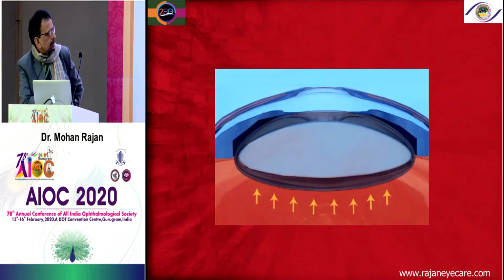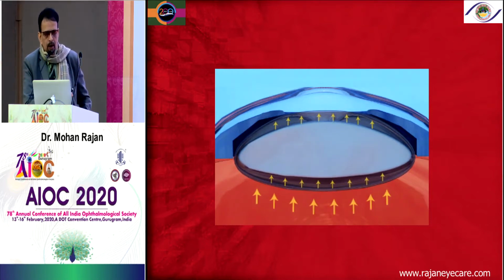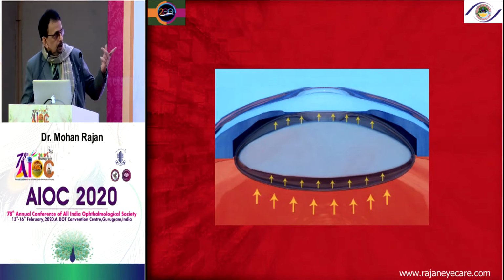So the most important thing is the 4 components which are working here. One is the pressure underneath the anterior capsule. The nucleus is bulky. There's a pressure in front of the posterior capsule. There's also a positive vitreous pressure. All these white cataracts I always do under peribulbar block, and also give a superpinky. I give preoperative mannitol and Diamox to reduce the vitreous pressure as well. This is the 4th component as well.